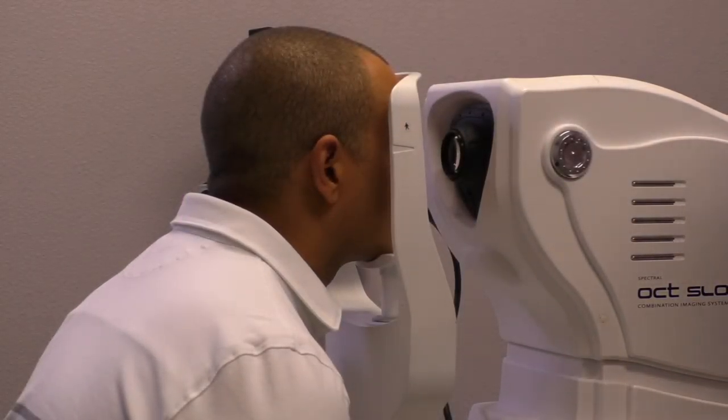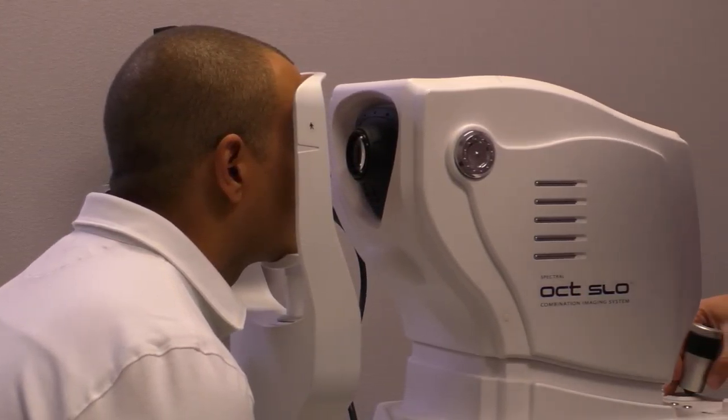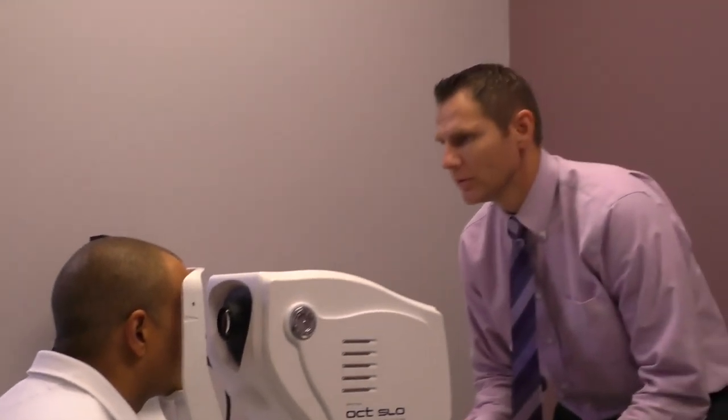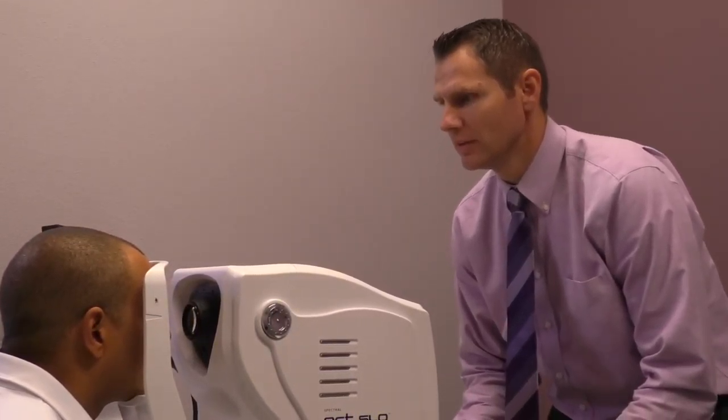We're going to have you blink a couple times, then open your eyes really wide and look straight ahead, right at that target. Perfect — hold it right there. Hold. And good.